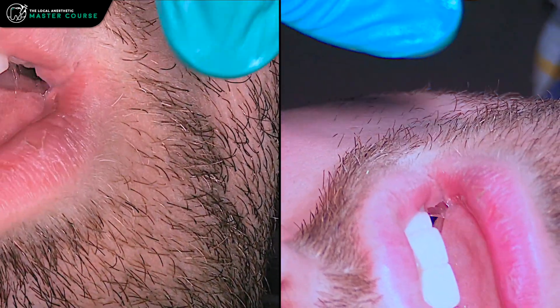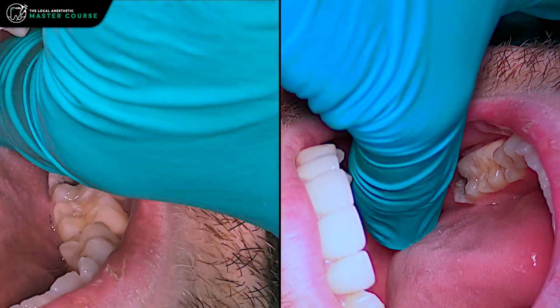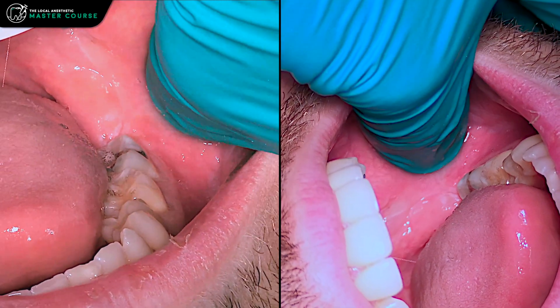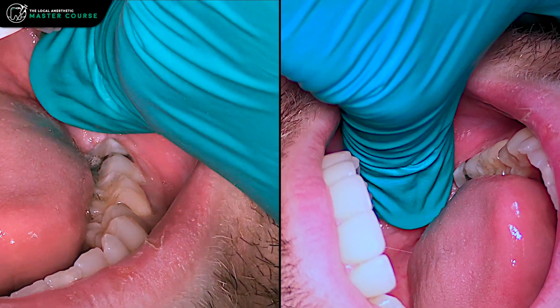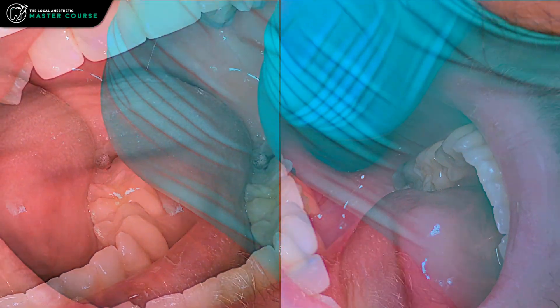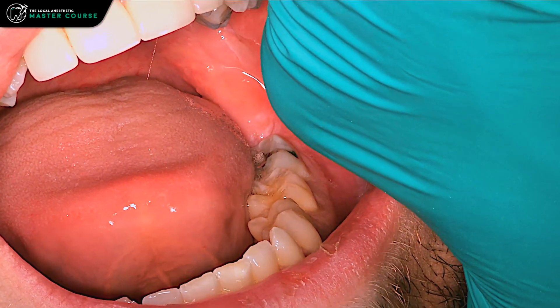Have the patient open really wide, then palpate for the coronoid notch, pull out laterally until you identify that anterior edge of the ramus, and then mirror the occlusal surface of the teeth.